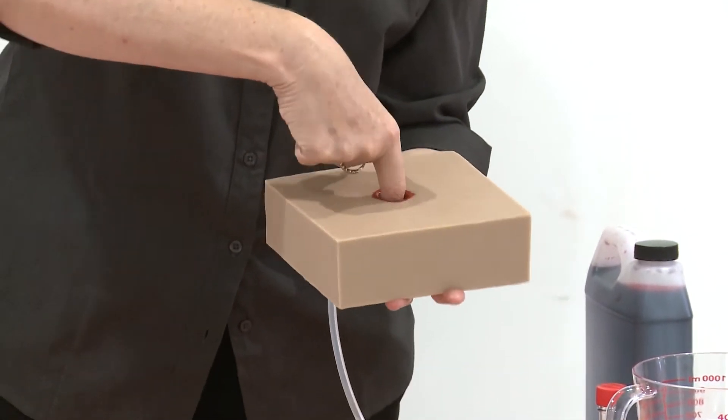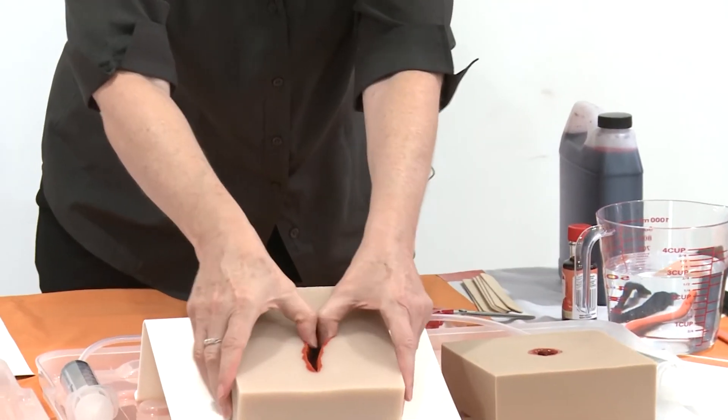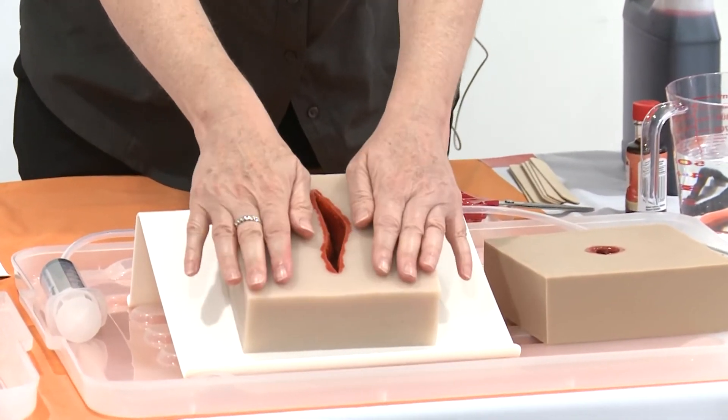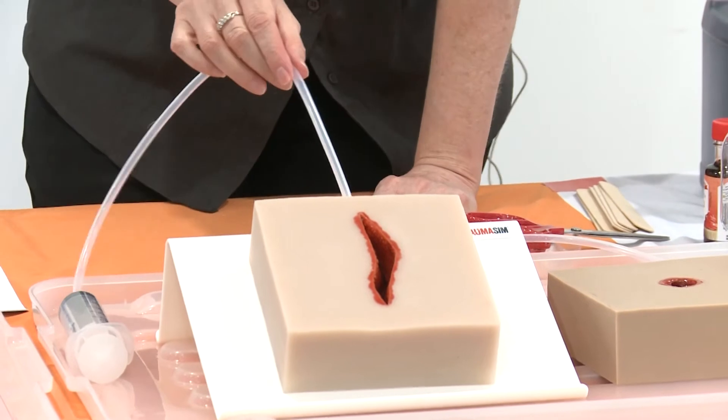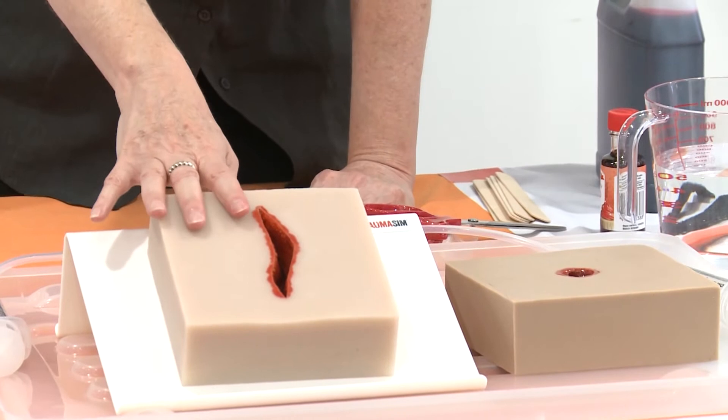The idea of this is that they can actually get into the source of the bleed and pack that internally, and the laceration is a big open wide laceration. These are all made with a silicon tube that goes directly into the base of it so that there's a source of bleeding for them.